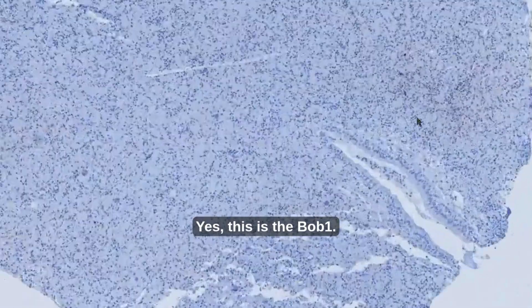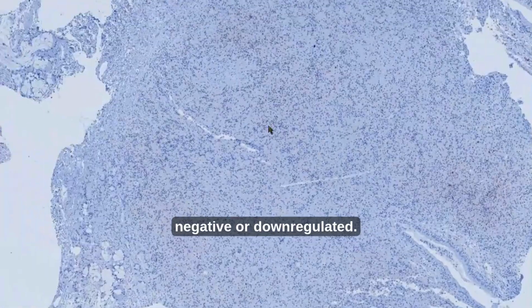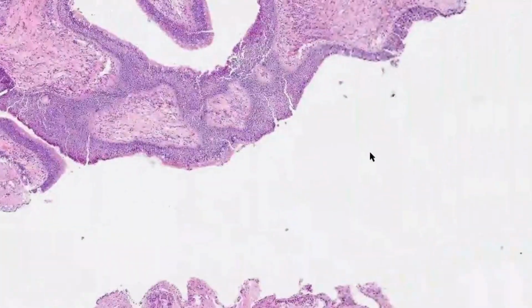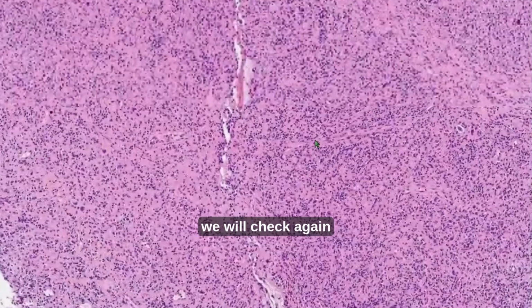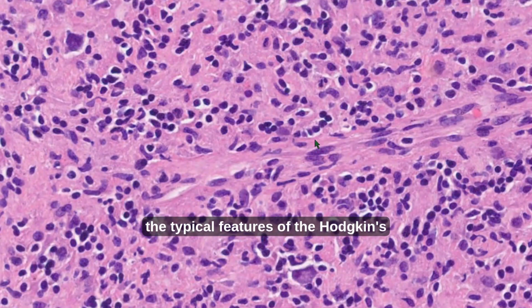Yes, this is the BOB1. It is negative or downregulated. Finally, we will check again the typical features of the Hodgkin lymphoma.